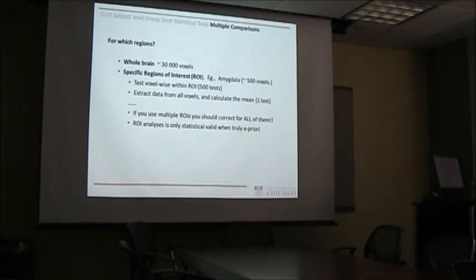That makes sense, right? But say you find a bunch of regions based on the test you're running now, patient group A versus patient group B. You then find a bunch of clusters, you extract them, and then start to correlate with symptom severity.